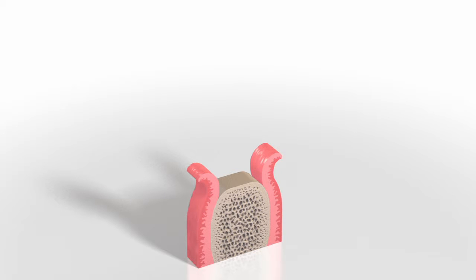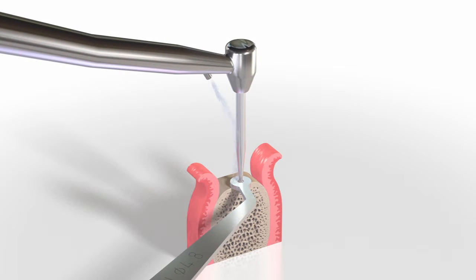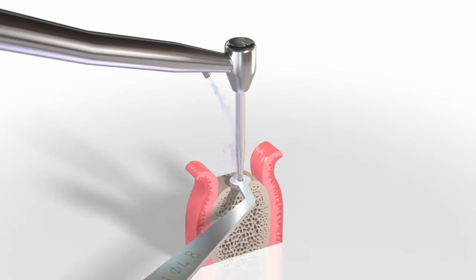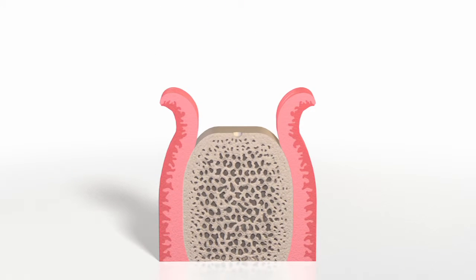The implantation site, which was determined during pre-operative implant position planning, is then marked with the 1.4 millimeter round burr. The implant distance indicator can be used for this purpose. The position of the mark is widened and corrected using the 2.3 millimeter or the 3.1 millimeter round burr, if necessary at 800 RPM maximum.